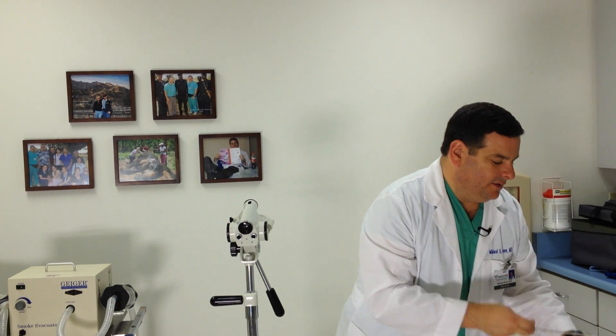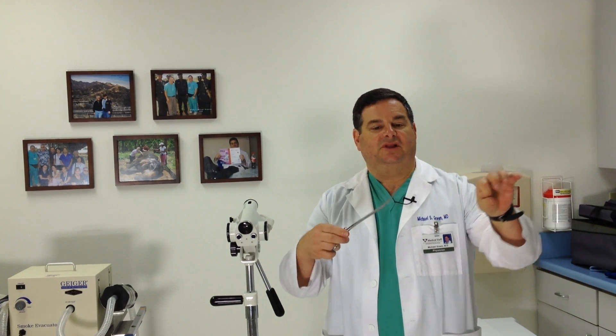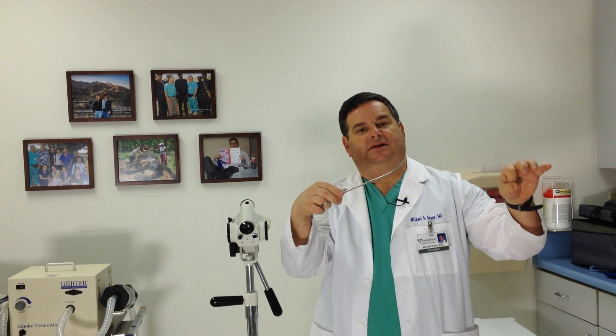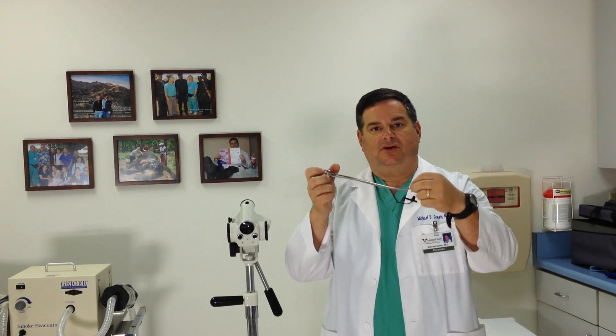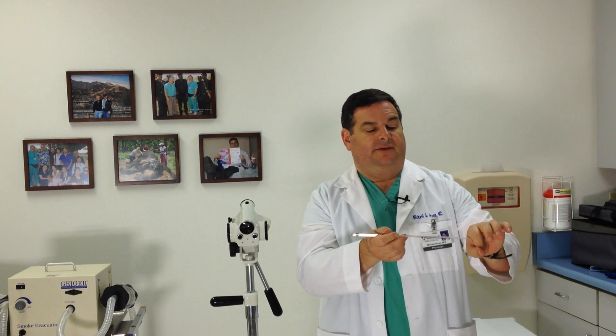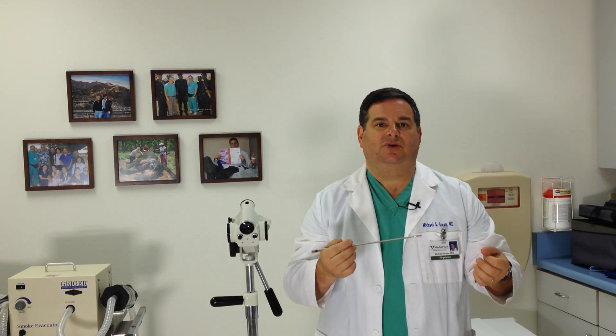That's taken out and put in solution. Then another instrument — this one is blunt and doesn't hurt — helps collect the cells. It's placed through the vagina and cells are collected and put into the solution as well. The equipment is long and curved to reach back to where the cervix is. The ECC does cause some cramping, and for the 10 or 15 seconds where the doctor's doing this, it will cramp and that's pretty uncomfortable — but it only lasts a few seconds and then it's over.